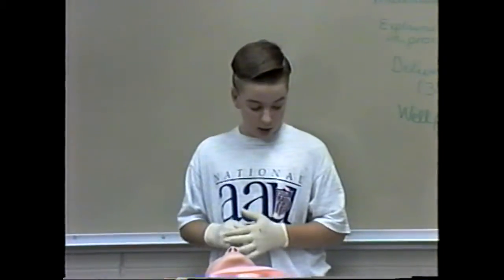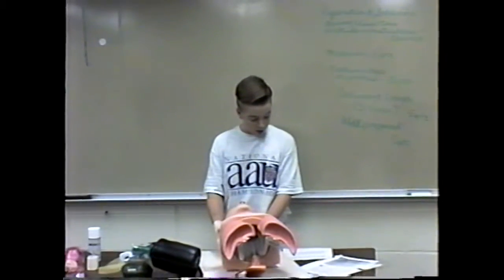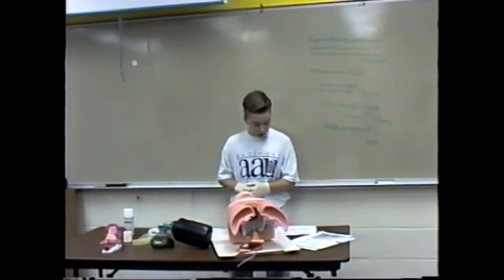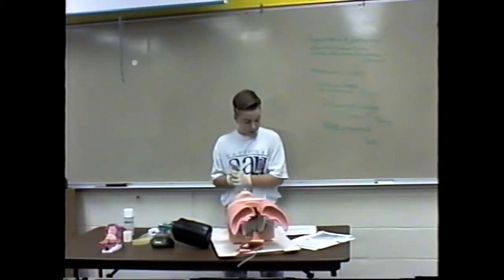Establishing an airway is the first step in the ABC process of resuscitation, which include airway as A, breathing as B, and C as circulation. Intubation is accomplished either orotracheally through the mouth or nasotracheally through the nose using an ET tube. The different ways to intubate may include using an ET tube or a combo tube.